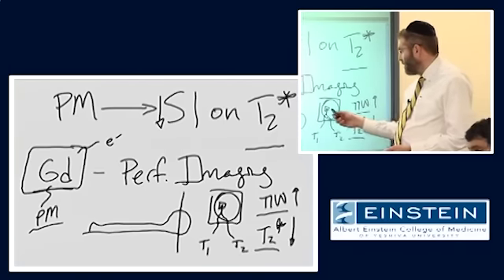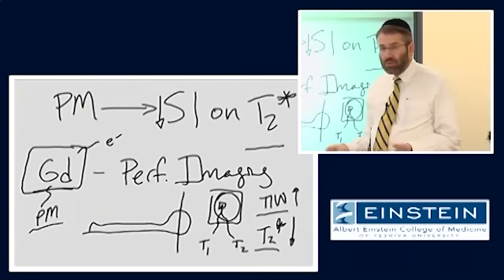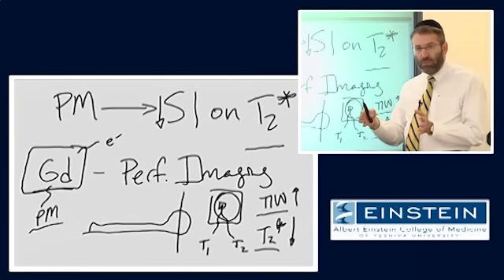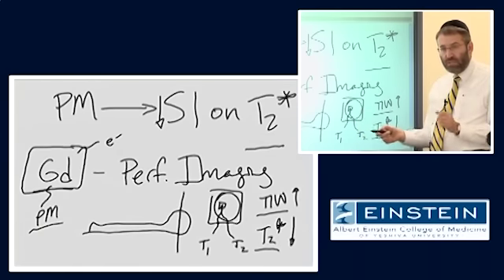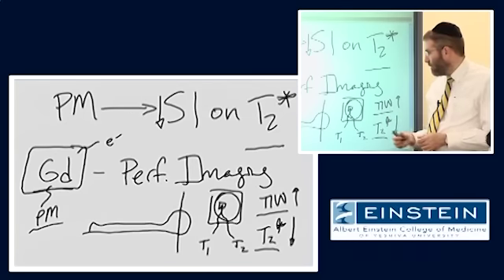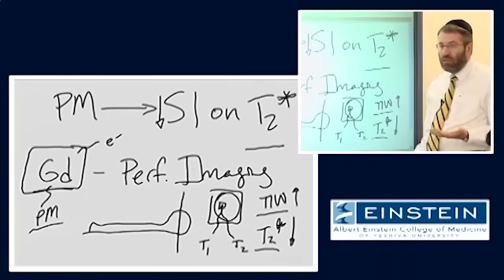If, for example, this contains some veins and some arteries and some capillaries and some tissue and some cerebrospinal fluid, right? Different components of that volume are going to take up different amounts of the contrast agent. So you're exactly right. There will be a gradient of magnetic susceptibility. If, for some reason, the gadolinium was absolutely uniformly distributed across the brain, then we wouldn't see any effect. But that's not the reality. Whenever you deliver a contrast agent intravascularly, the same amount doesn't go everywhere.